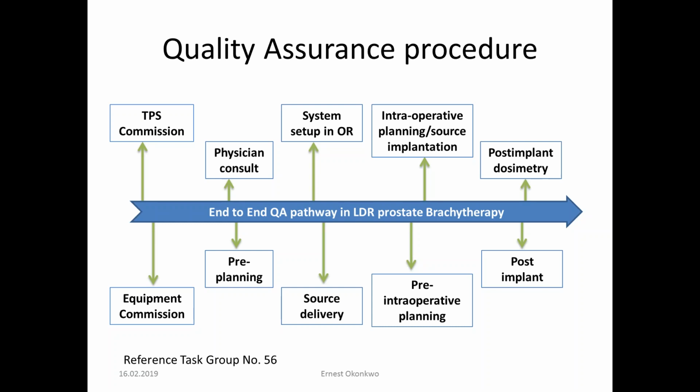I will just keep this pre-operative planning because it's also included here. And then for the post-implant, the post-implant is what do you do after you have implanted your seeds? What do you do with the remaining seeds? How do you make sure that there are no seeds missing?